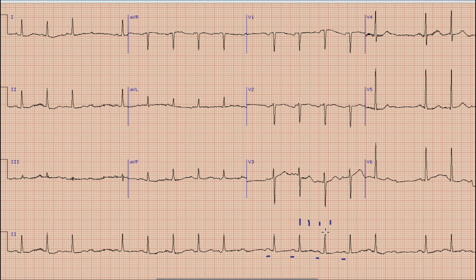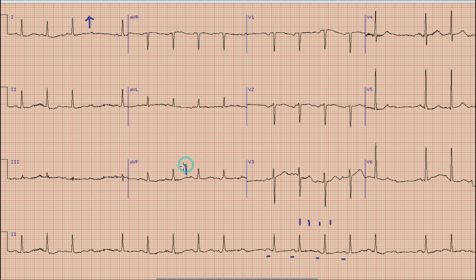For axis, we look at Lead I and AVF. In Lead I the QRS complex is directed upwards, and in AVF the direction of the QRS complex is upwards as well, so the axis is normal in this ECG.